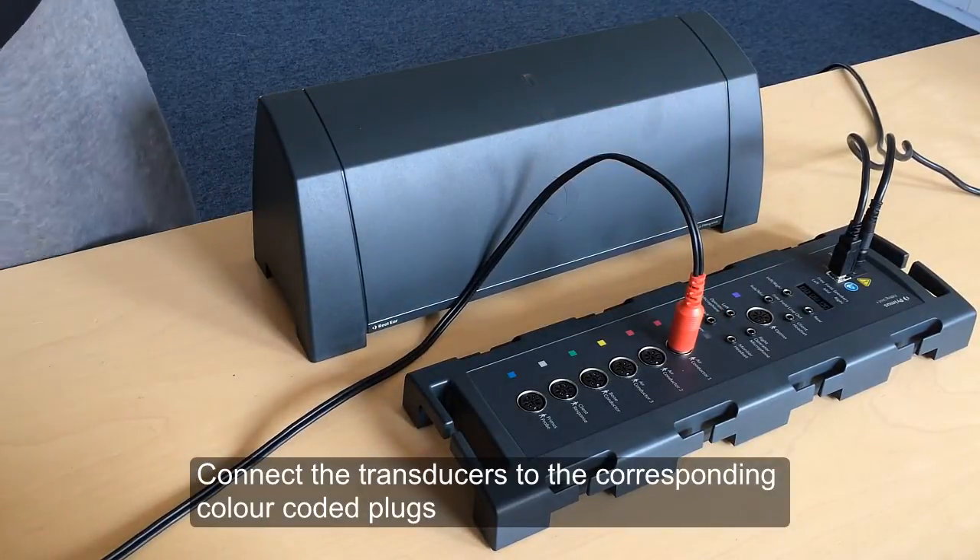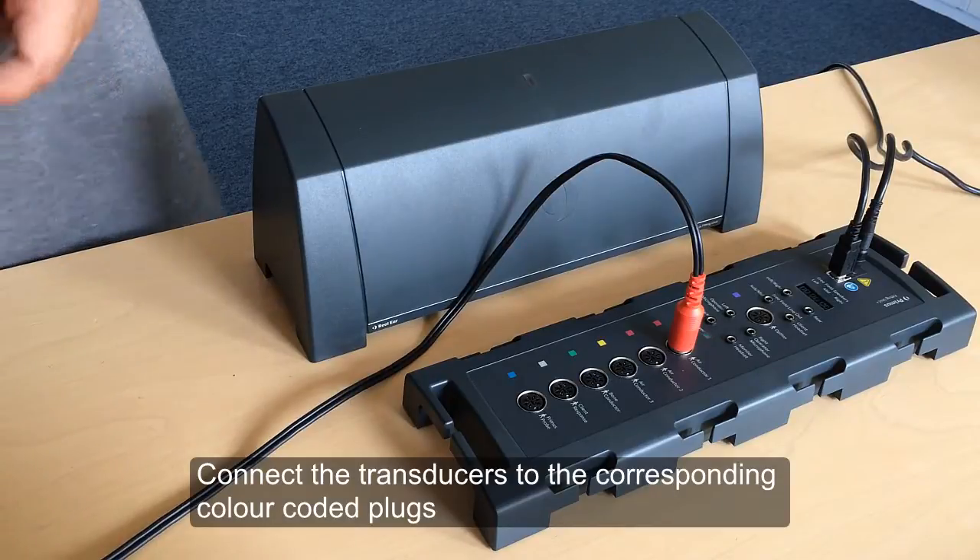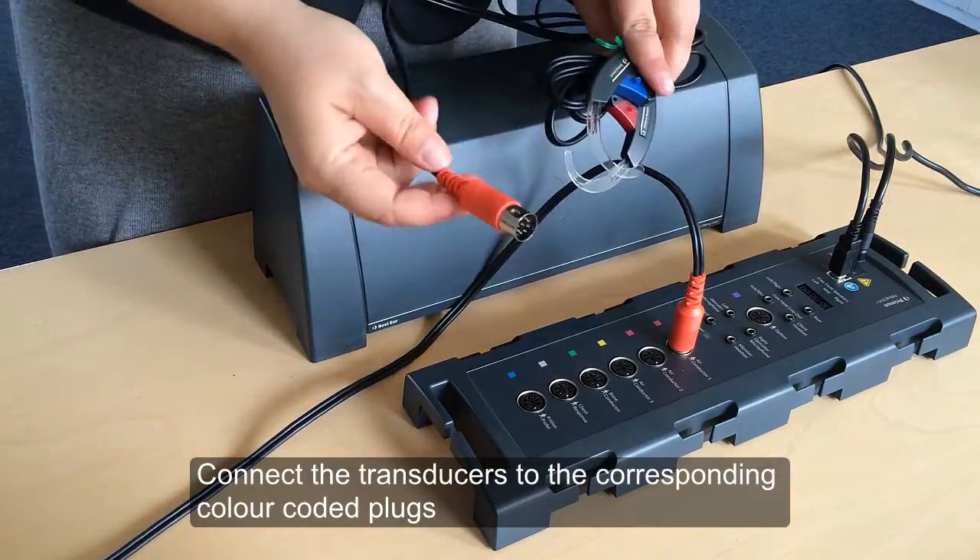The plugs on the individual transducers come in specific colours and should be plugged into the connector marked by the same colour on the fitting unit.